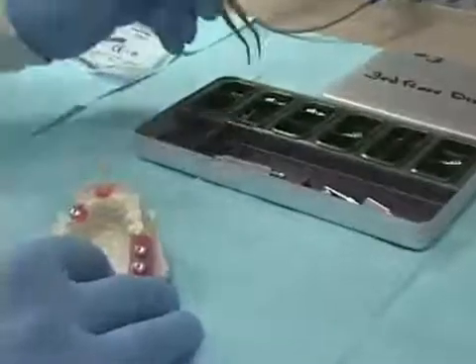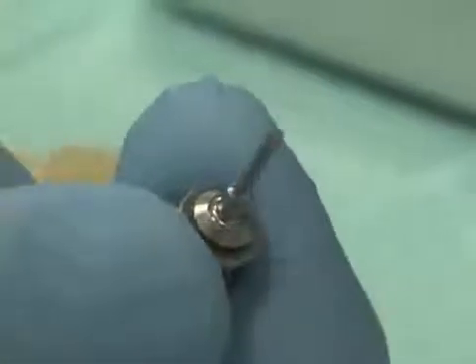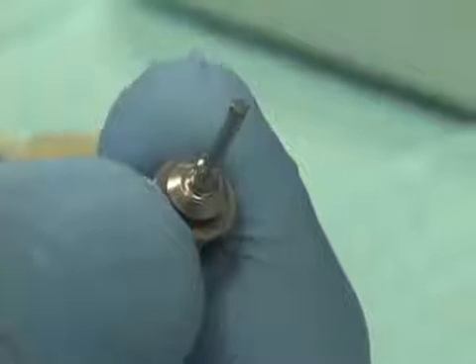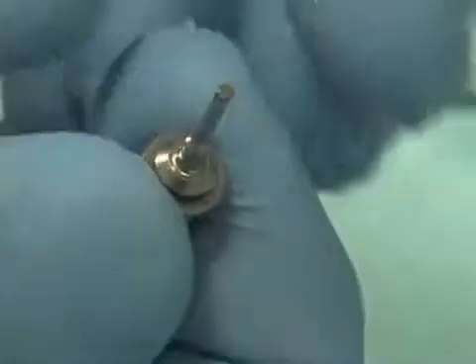So if we take our patient and I pick out a screwdriver, and you can see it may show up reasonably well, the end of this looks a little bit like a star shape or a Torx wrench. Now that shape is also the recess in the top of our healing screws.